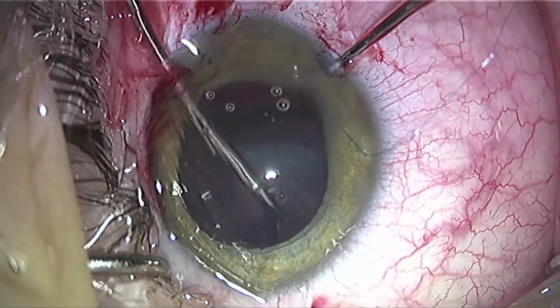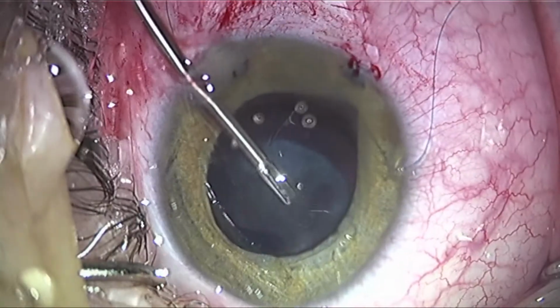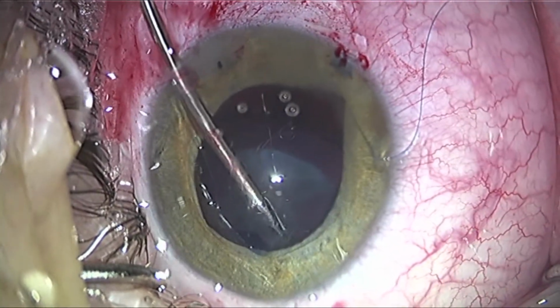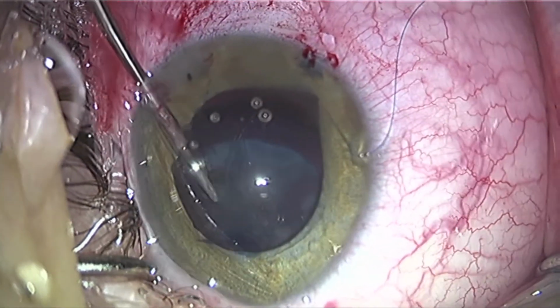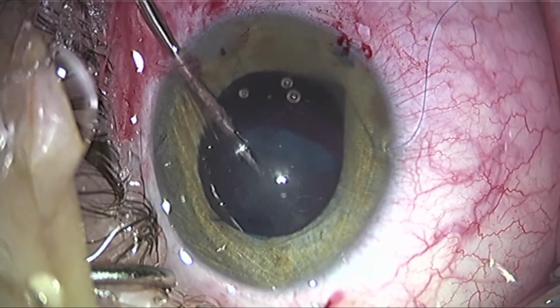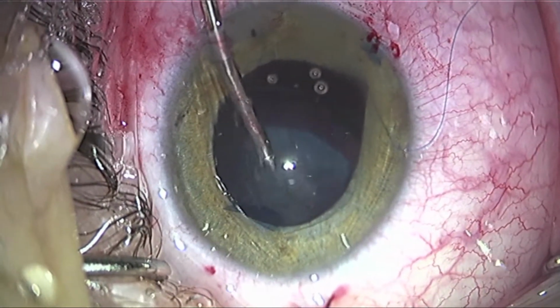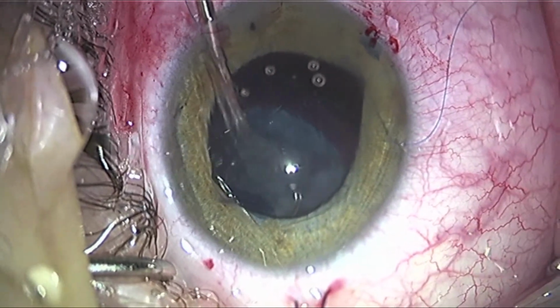You notice that the segment is in no way oriented where it needs to go. It actually needs to go to the upper part of the frame here to bring that lens over into position. So I then used these Duet forceps to really rotate this segment into the correct position. And this lens was relatively soft, so it was able to move pretty easily.